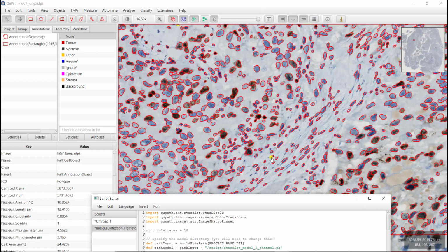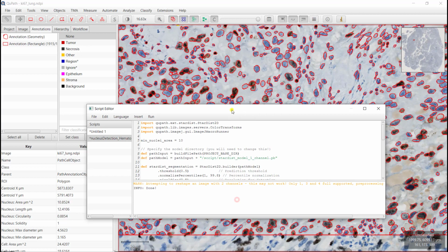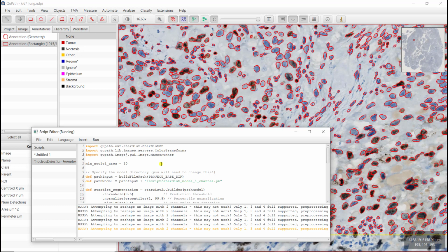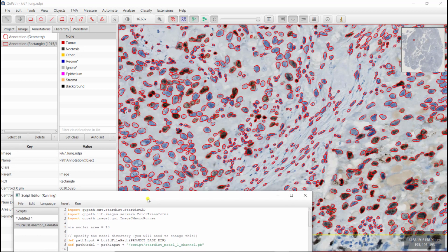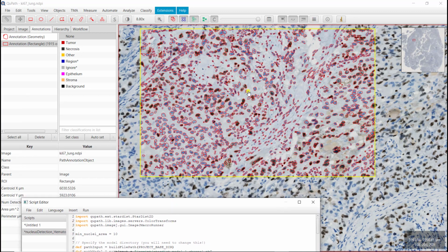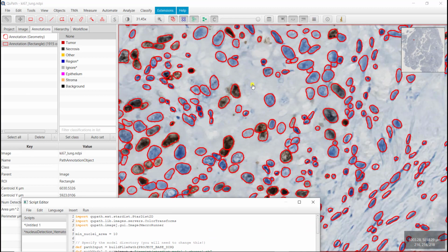Overall, it's not perfect, but it's quite nice because when you look, oh, I forgot to select it again. What is really nice is that here I just used a data set that was publicly available. You didn't have to annotate anything by hand. I didn't have this kind of images. I just had fluorescence images. And by just doing the stain deconvolution and combining them, I'm able to get very nice results. So it's not perfect, but really for the time I spent doing that, it's quite amazing.